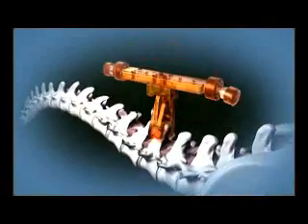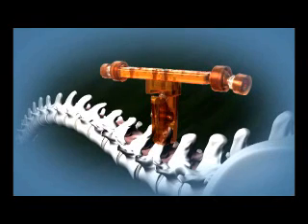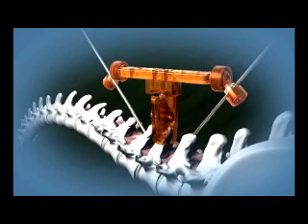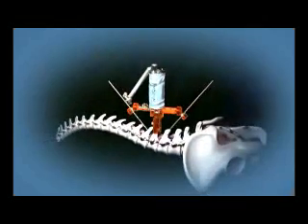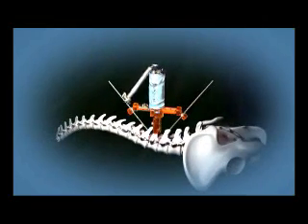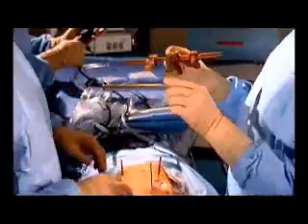Clinical use has also included pedicle screw placements in the lumbar spine during open surgeries, where the miniature robotic device is attached directly to the exposed spinous process using a clamp and bridge. Once the clamp is attached, the remainder of the process is identical to the T-frame approach.